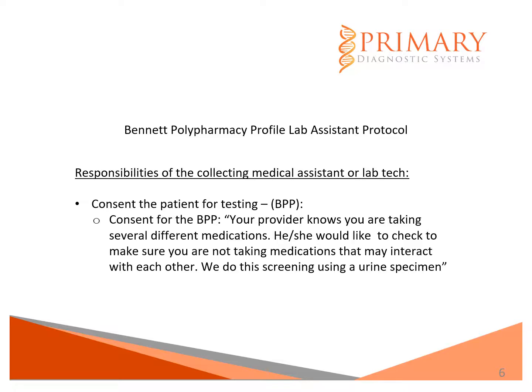The consent for each patient reads as follows. Your provider knows you are taking several different medications. He or she would like to check to make sure you're not taking medications that may interact with each other. We do this screening using a urine specimen.